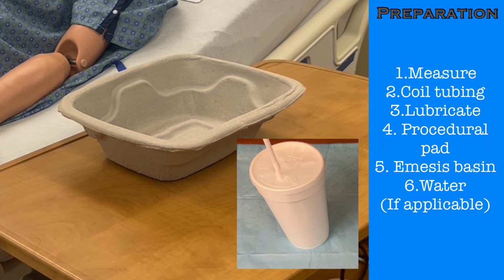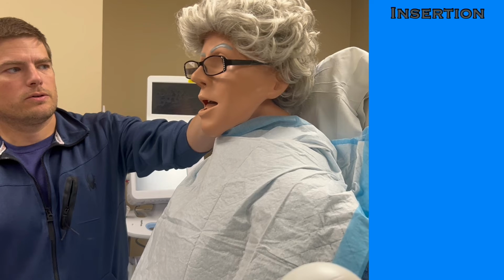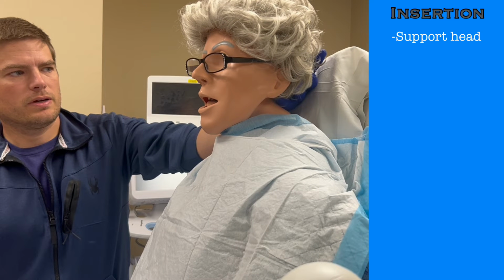But this isn't necessary for insertion. It can just make it a little easier. This will be unpleasant for the patient. They will feel a lot of pressure in the back of their nose at first, and then they will have to contend with their gag reflex. Many patients will not be able to resist fighting the insertion, so you may need to gently support the back of their head with one hand so they can't easily pull away from you.